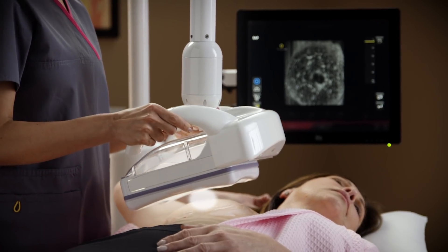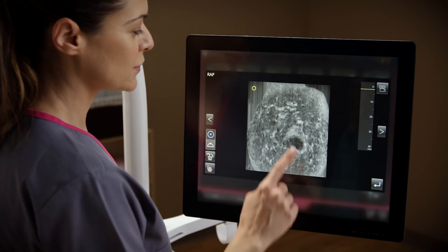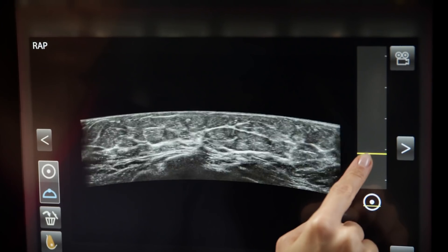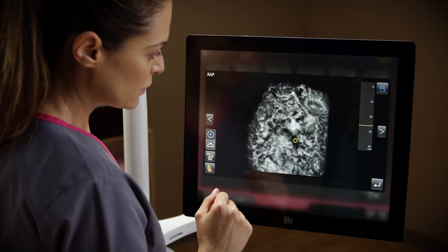After the acquisition is complete, a coronal view is displayed. The operator marks the nipple and performs a quality assessment review using either coronal or transverse data. The CINE review function can also be used to automate the review.